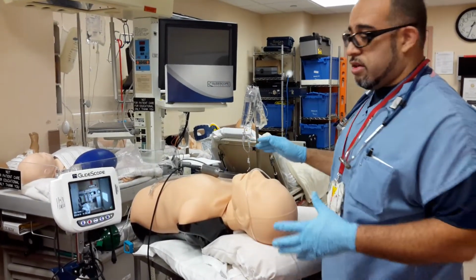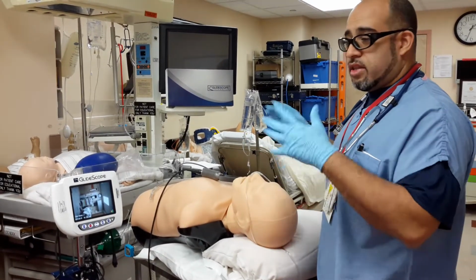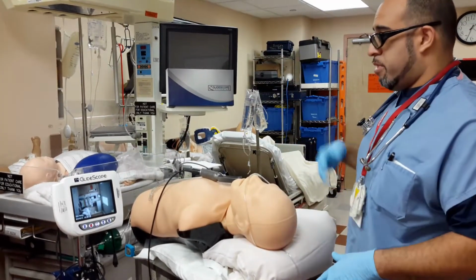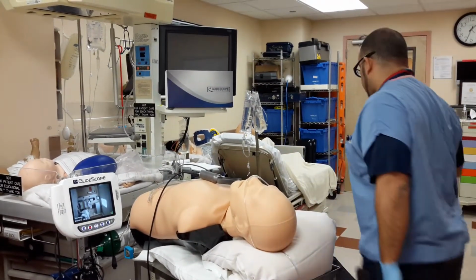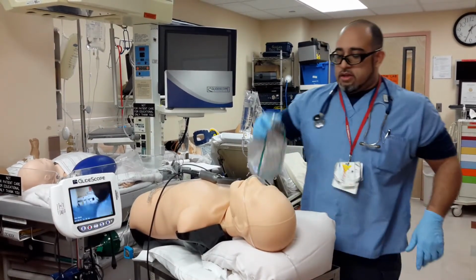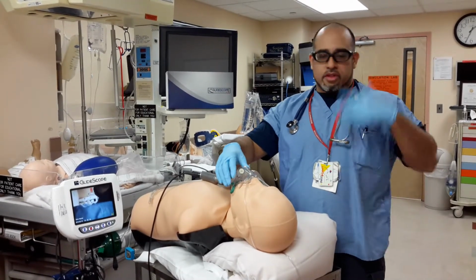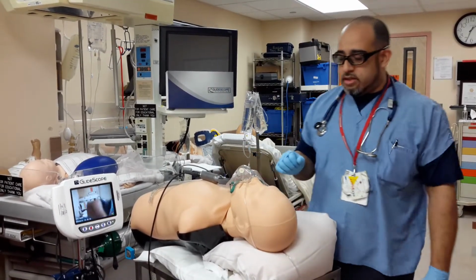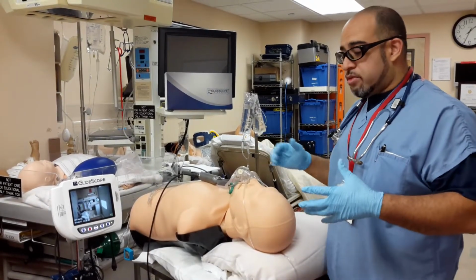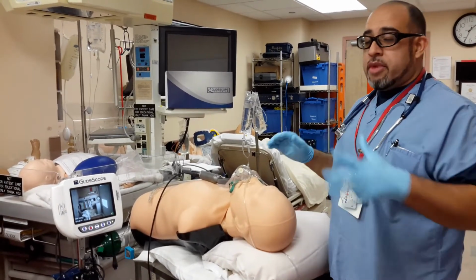IV's already in this. I'll pretend that the patient has an IV, got his medicines ready. Patients have been oxygenating on their own, breathing on their own. High flow, 15, 20, 30 liters, high flow. They're spontaneously breathing. They got their medicines. 45 seconds passed. 2 minutes passed with etomidate or succs or rocuronium, or ketamine, whatever combination you want.